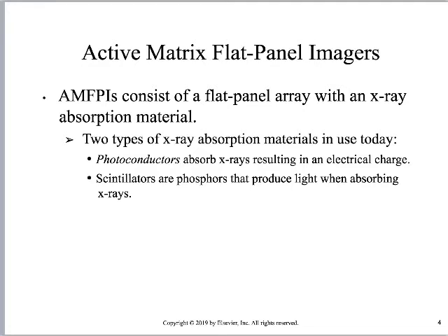So for the absorption materials, we're going to use either photoconductors or photoscintillators, right? An example of a photoconductor is amorphous selenium. Amorphous selenium has the ability that if an X-ray interacts with it, it produces electricity. That's what photoconduction means. X-rays are essentially a form of invisible light. So in the presence of light or in the presence of something, they emit what? Electricity. That's what conduction means. So that amorphous selenium is that photoconductor, right?